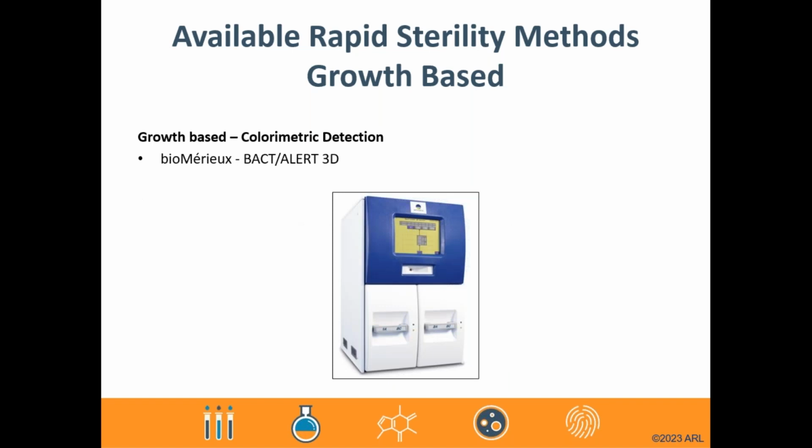One common rapid sterility system which utilizes the colorimetric detection is the BACT-ALERT 3D, and that's from bioMérieux. This system was originally designed for clinical applications, but has since been found to be suitable for some pharmaceutical testing. Testing using the BACT-ALERT 3D equipment begins with samples being added directly to bottles of liquid culture media, which are then incubated inside the system, and that's at one of two different temperatures. During certain types of microbial growth, CO2 in the closed container would then accumulate and diffuse into a sensor at the base of the bottle, which then produces a measurable output. One notable benefit of the system is that it automatically monitors the sensors, and it does that every 10 minutes, so that provides very up-to-date test data.